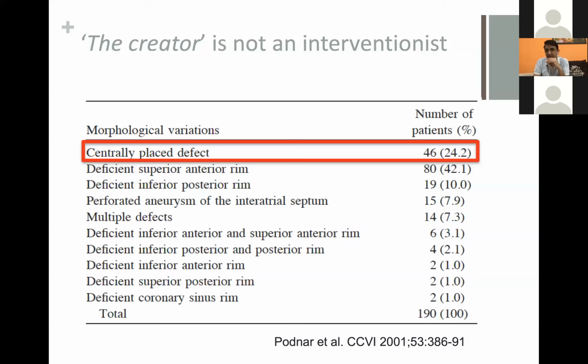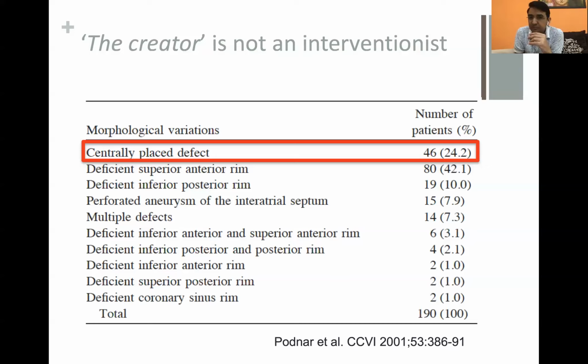It's a very uncommon situation, and usually it is a small defect. So many a time, even if we may be seeing it, we might be just leaving it because it's a small defect. But most of the time, whatever images I have seen are from the specimens, and I haven't come across a transesophageal echo of that. So I'm sure what you are saying is right, sir. More so because it's small. We don't come across too many patients who have a deficient mitral margin, and that being a feature for rejecting a patient out of the interventional group.